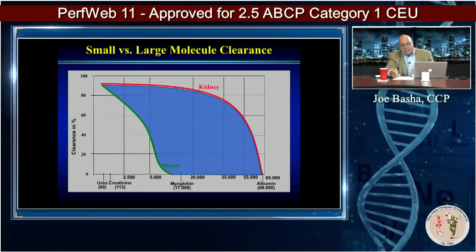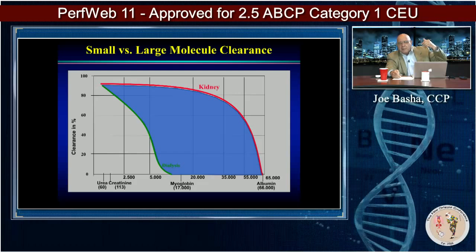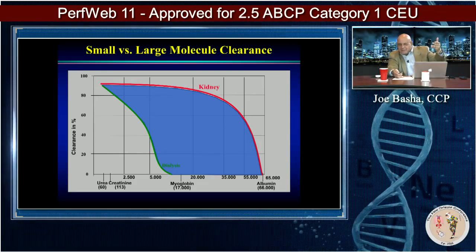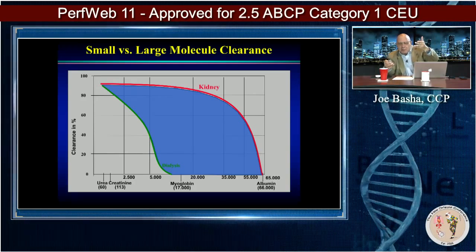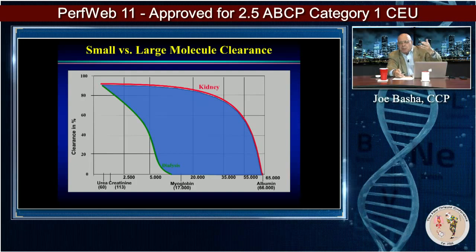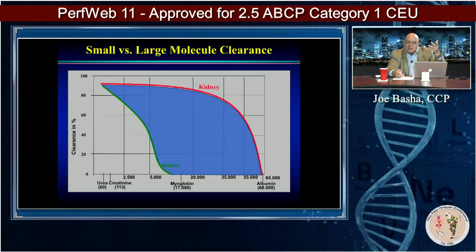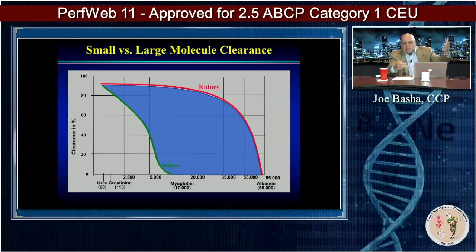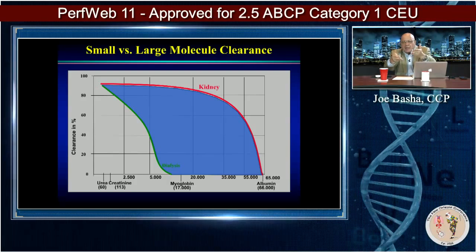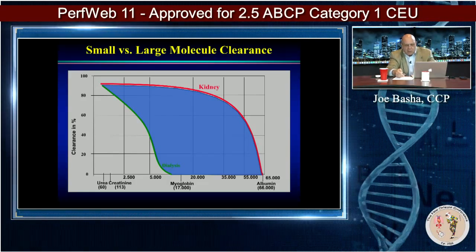For every yin, there's a yang. But if you have a grossly elevated level of pro-inflammatory mediators and a depressed level of anti-inflammatory mediators, and you're removing a block of volume containing both, you are disproportionately clearing the pro-inflammatory mediators at a greater level until you can get it reduced to a point where the anti-inflammatory mediator process can start to balance the patient out with its own natural homeostasis.